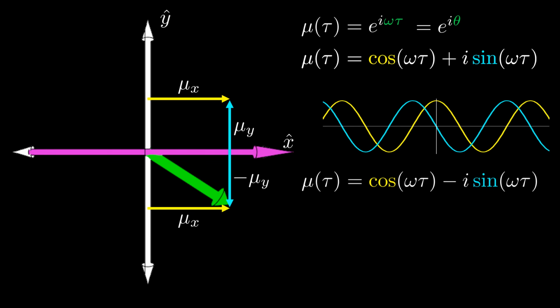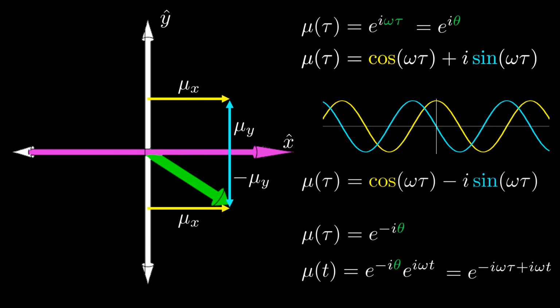The reversal of the imaginary component mathematically switches the phase we've accumulated from positive to negative, minus theta. Our system will continue to evolve, progressing in phase counterclockwise at rate omega t. The total accumulated phase will thus be 0 when our time t equals tau, and we'll detect an echo. Pretty neat, huh? The math is nice and simple here, where B1 is aligned along the real axis, but perhaps you can extend the math for cases of B1 delivered at an arbitrary angle to the system.